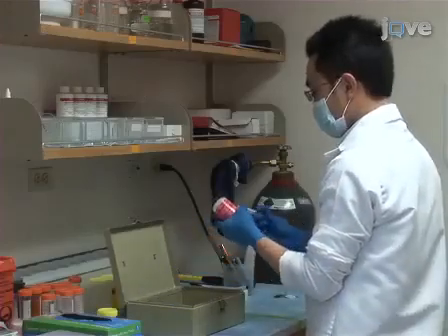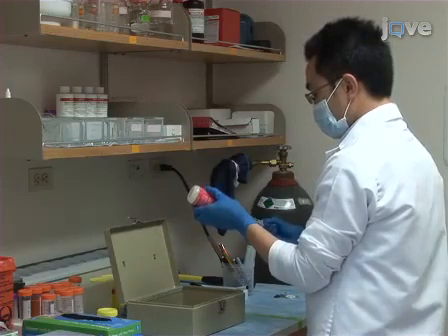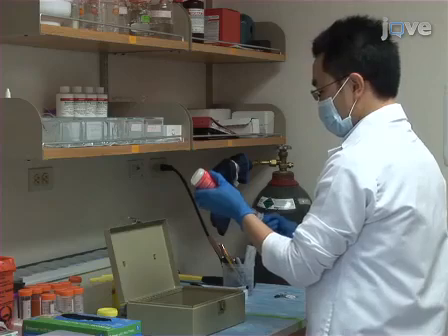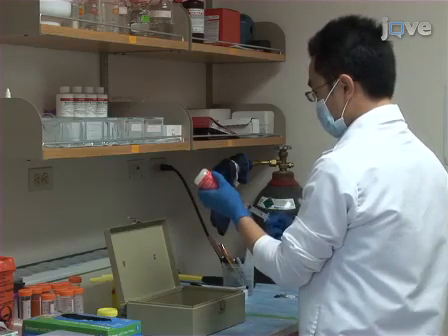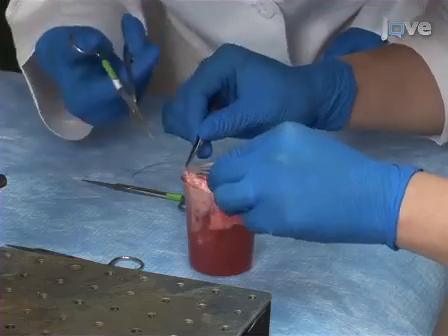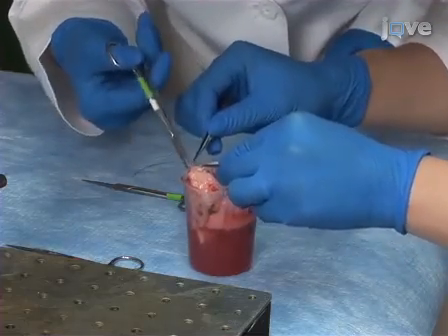Once prepared for surgery, euthanize a rabbit with a cocktail of sodium pentobarbital and heparin. As soon as the rabbit fails to respond to a pain reflex, open its chest and excise the heart and lungs. Make a cut at the upper end of the ascending aorta before all the branches of the aortic arch.